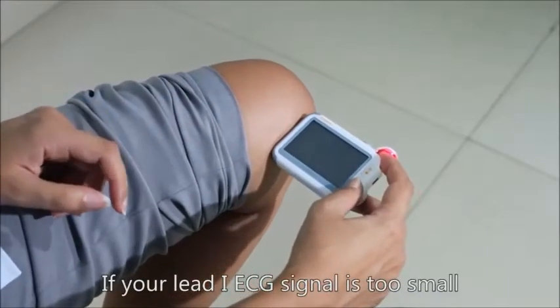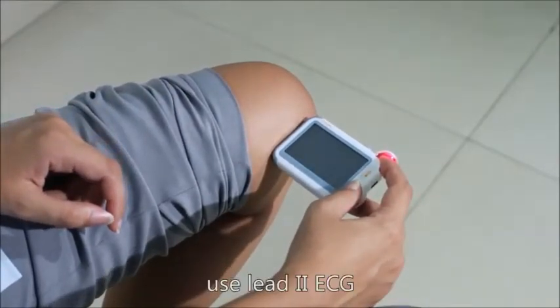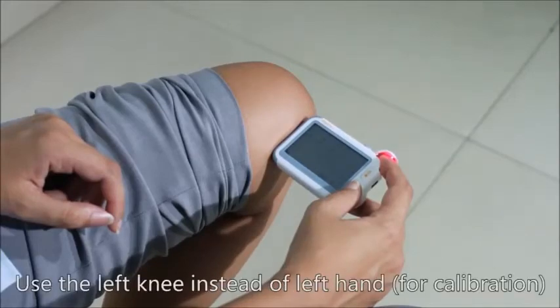If your lead 1 ECG signal is too small, use lead 2 ECG. Use the left knee instead of the left hand.